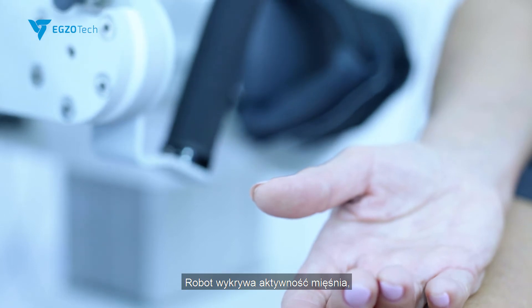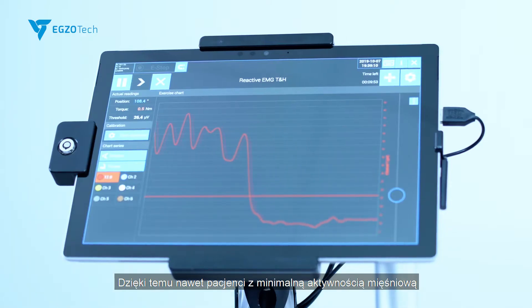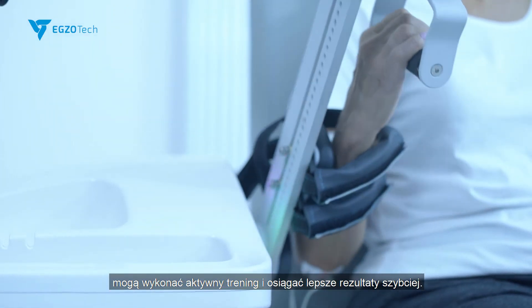The robot detects muscle activity and assists with the motion if patients get beyond the threshold line. Due to that, even patients with a slight muscle contraction can work actively and get better results quicker.